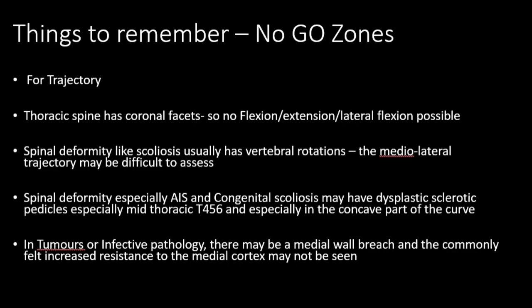So these things hold even though there is curvature and vertebral rotation, and when the vertebra is rotated, the superior articular process will also be rotated.